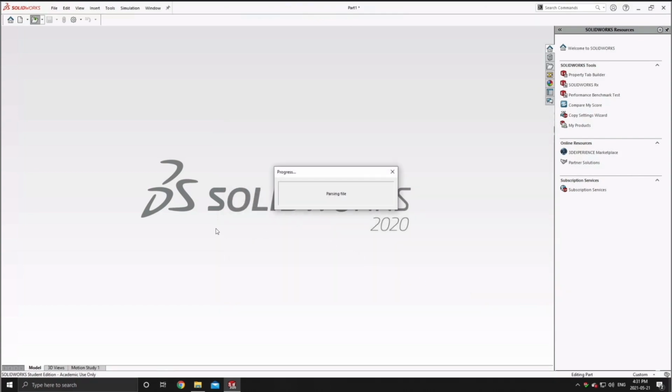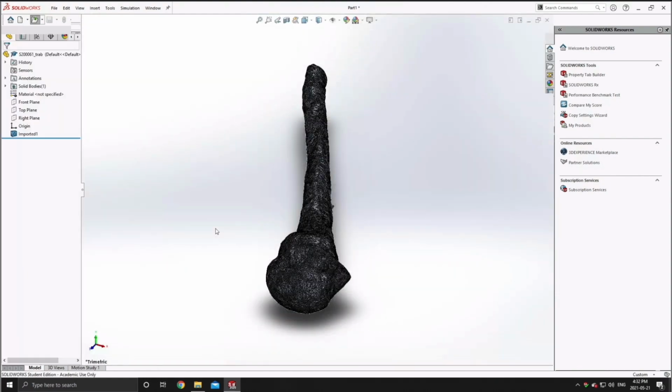Now, the output of your 3D bone model generation are going to be two .stl files. Those are the ASCII STLs, and those are outputted by Mimics itself as the export file format that you're going to use when taking your 3D bone models and putting them into a SolidWorks part file.